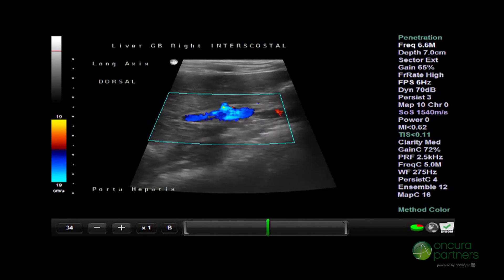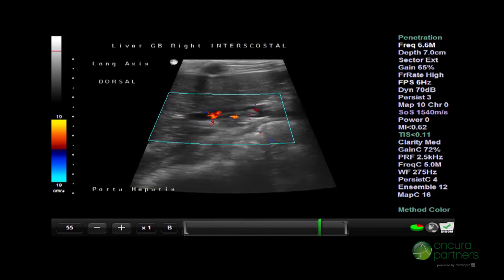During this procedure, include video comparing the liver and spleen echogenicities.